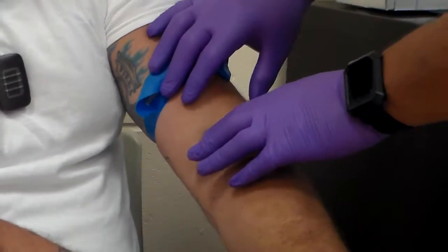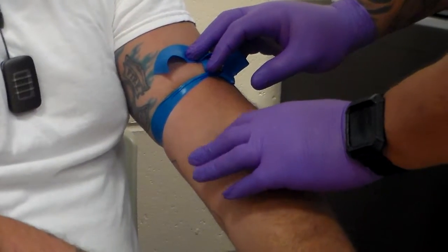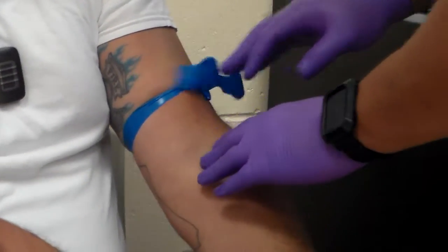Remember that this needle is an 18-gauge needle, so it is somewhat larger. You'll find your appropriate site and prepare for venipuncture.